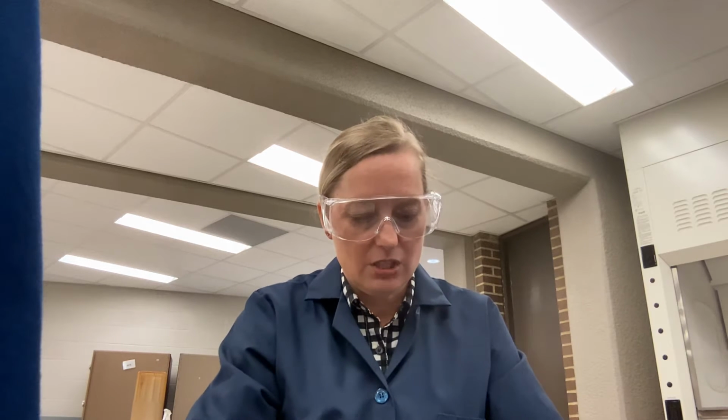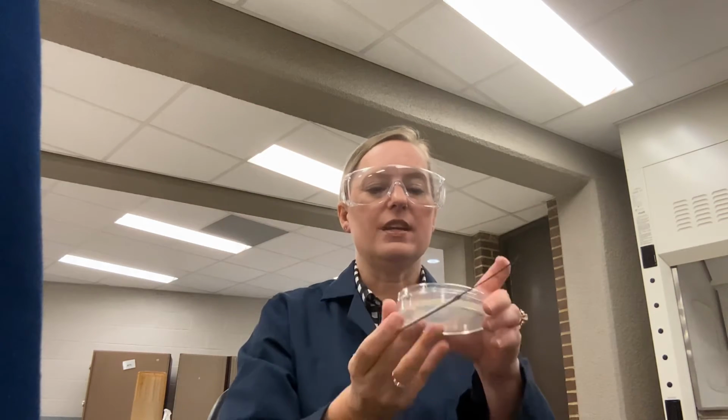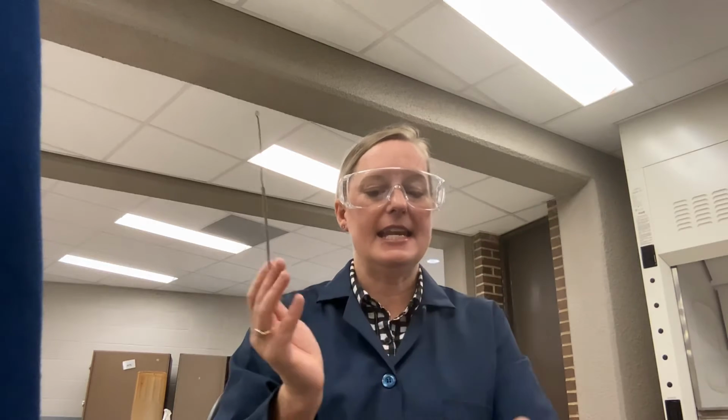And I'm going to very gently, which I'll help you see this in just a second, because we're going to do it 4 times, very gently go back and forth in what I called zone 1. We are also going to do back and forth in that zone 1 and make sure that we get from edge to edge of that particular area. And again, I'm going to do this 4 times, so I'll make sure that I zoom in so you can see it the next time. When we do all of these, we're going to barely lift the lids to not add any contaminants.